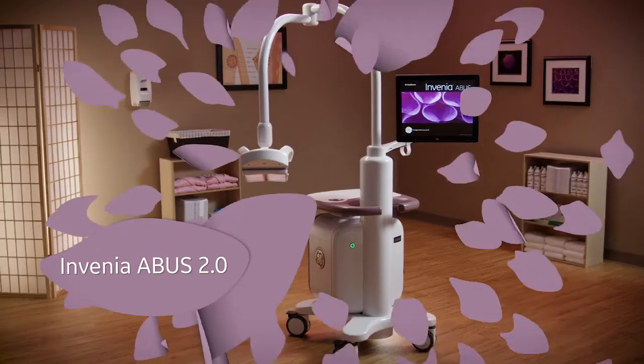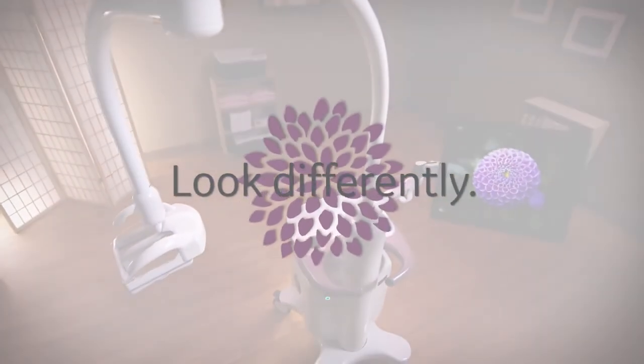Invenia ABUS 2.0 — helping physicians and patients look differently at dense breast tissue.